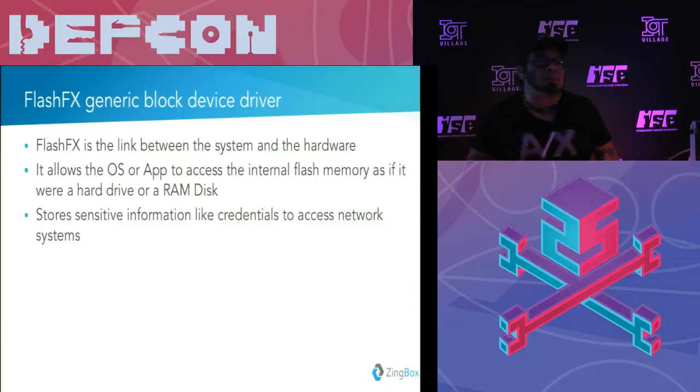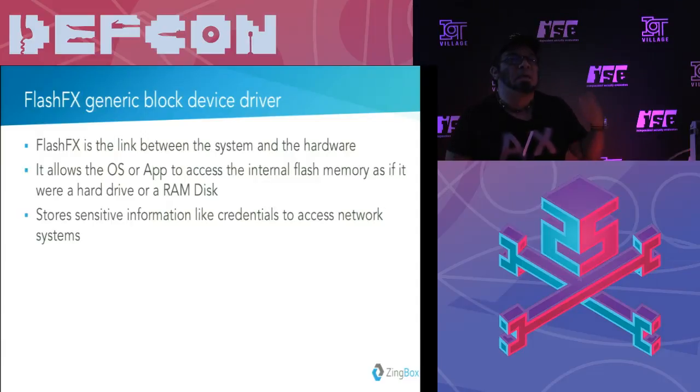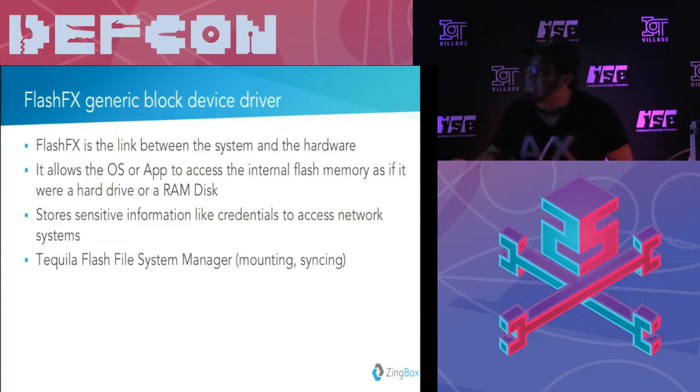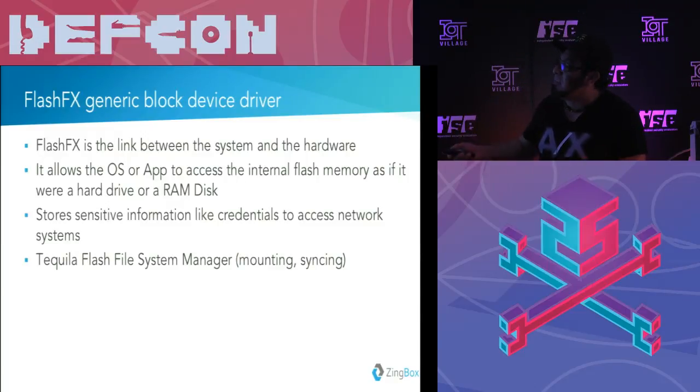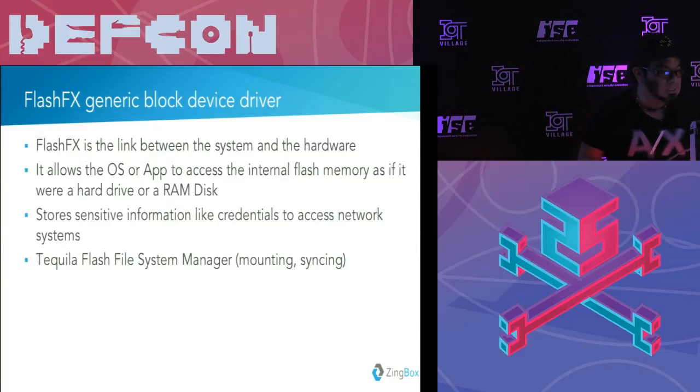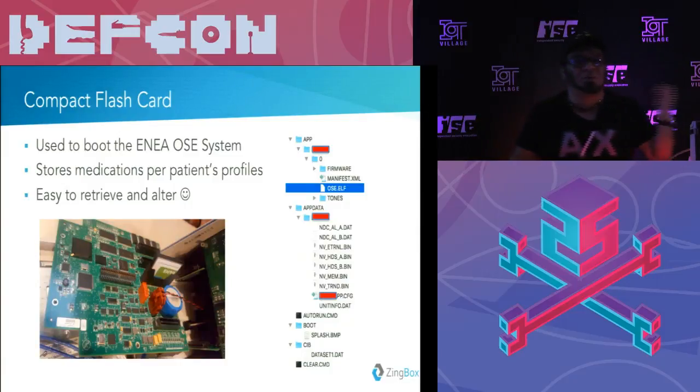Obviously, as expected, the flash stores sensitive information, like credentials to get access to the network and the access points. So there is something stored in that kind of flash, as usual. Very interesting, there is a file system manager called Tequila. I don't know why they call it that, but I Googled it. There is no information about Tequila, but basically it's just a file system manager for this Flash FX. That really motivated me when I was doing this research, because it's for Mexico, you know, right, Tequila?